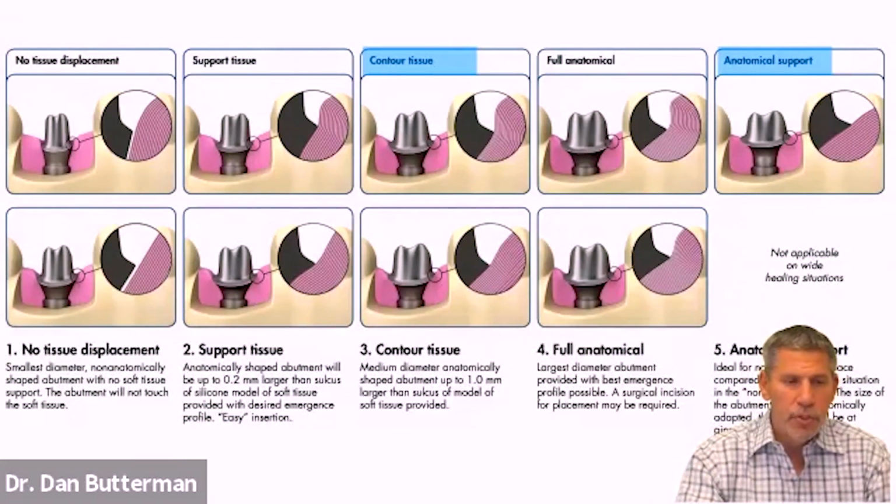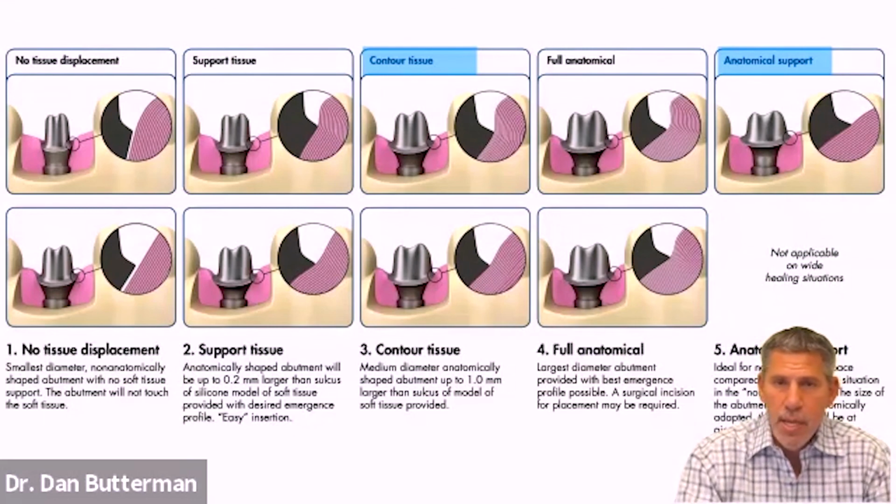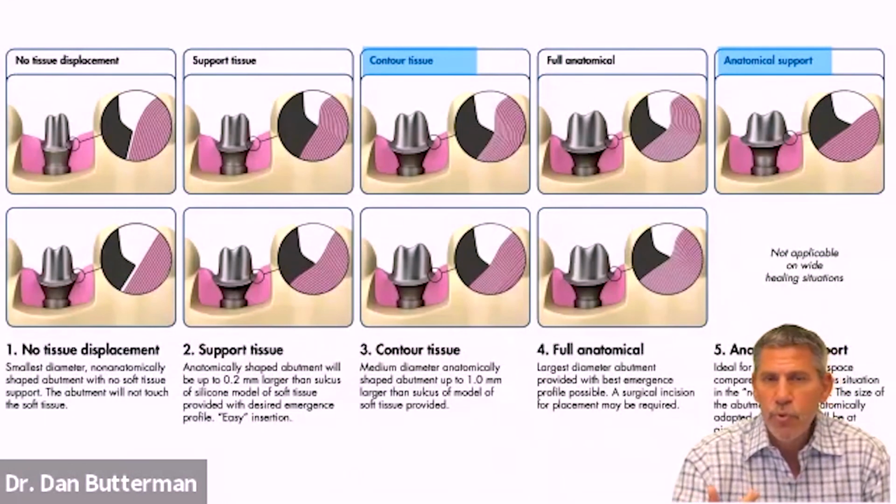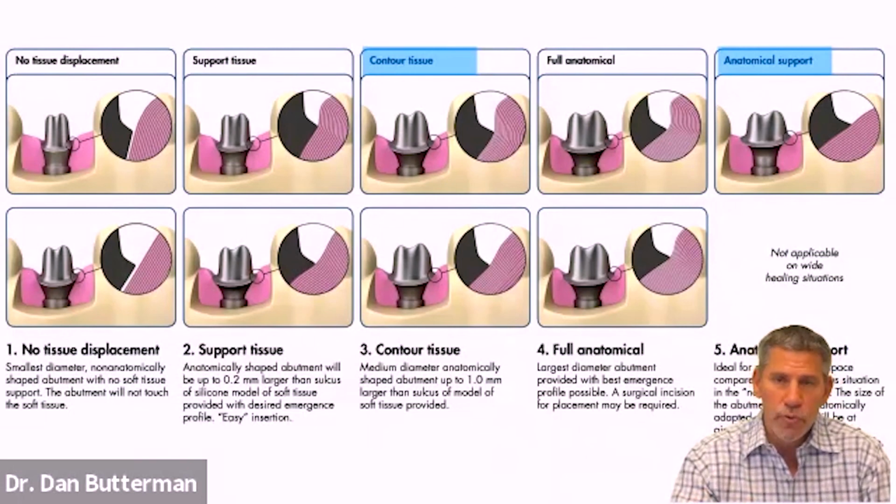Do you 3D print surgical guides or mill them? What are pros and cons of each? The answer is yes. I do both. Generally, my personal preference is to mill them because a block is going to be about $50, and I know that the precision and the fit is going to be 100% accurate with no room for error in it. I do 3D print as well.